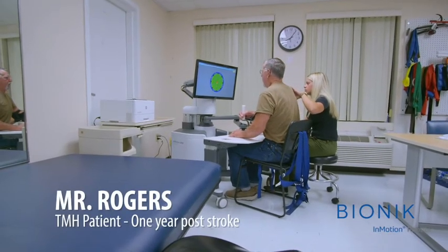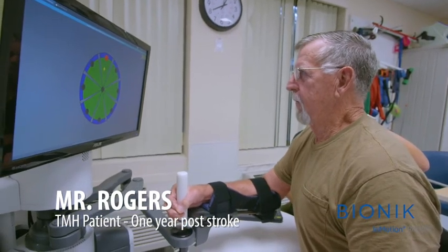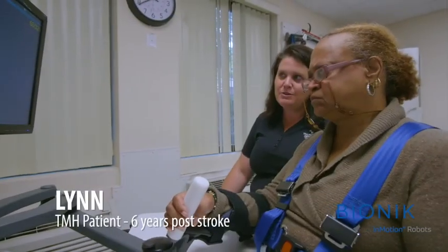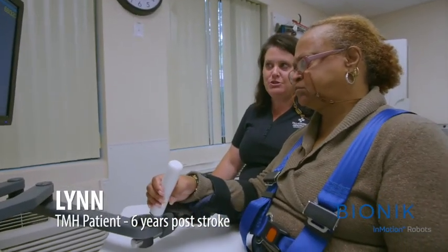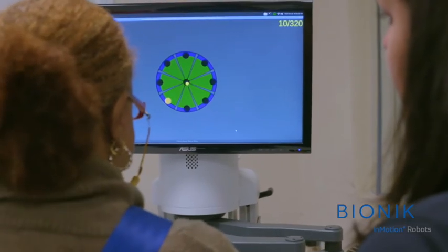I was so excited when we got the robotic arm because it meant we had an addition and enhancement to what we're already doing. The robot has been highly utilized since arriving here just a few months ago. At first we thought it would just be our stroke survivors that would be using it, but I would say it's a rare day that I can come into the room where the robot is and it's not in use by a patient.